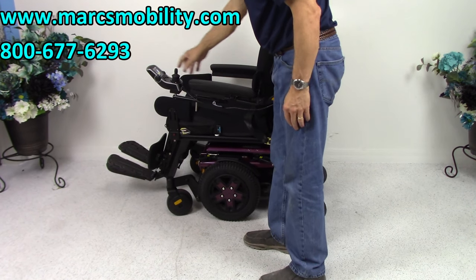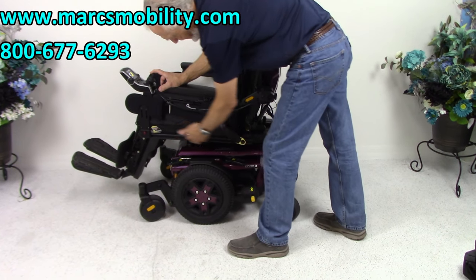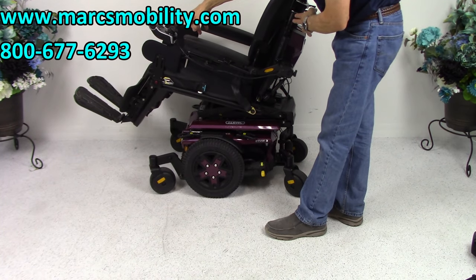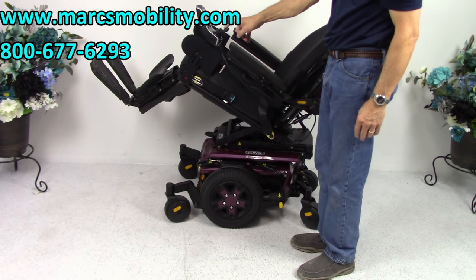The next function I'm going to show is called the electric tilt. The electric tilt is when the base right here goes back — it's going to take the legs and the back together with it. This is called the electric tilt.